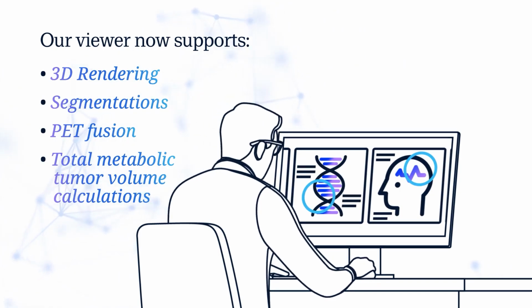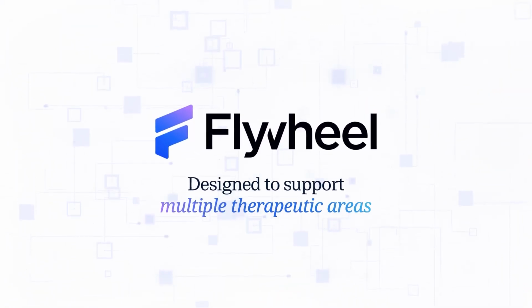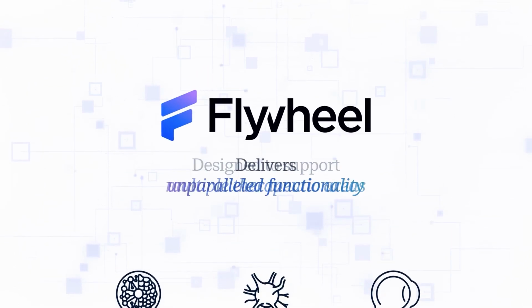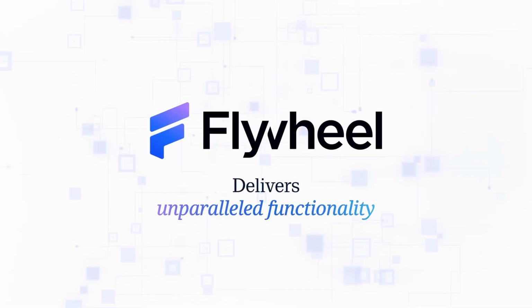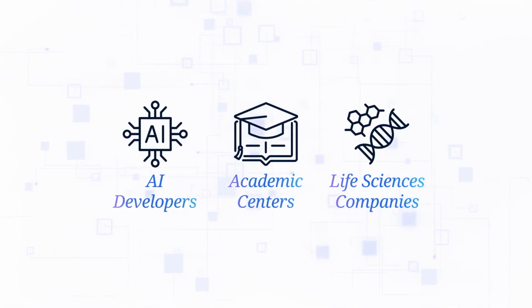With a flexible and robust platform designed to support multiple therapeutic areas such as oncology, neurology, and ophthalmology, Flywheel delivers unparalleled functionality, empowering life sciences companies, academic centers, and AI developers to get the most out of their imaging data.